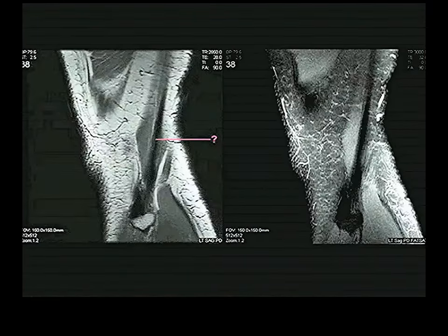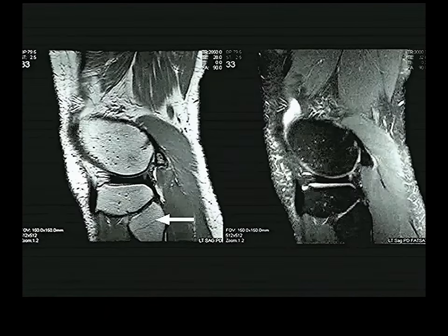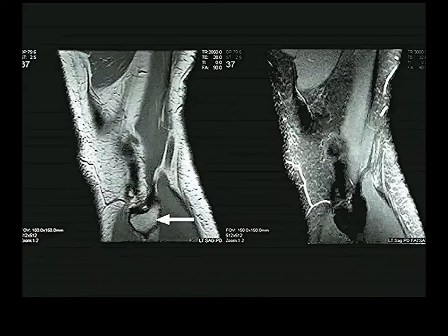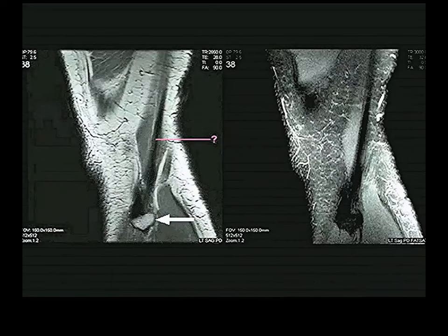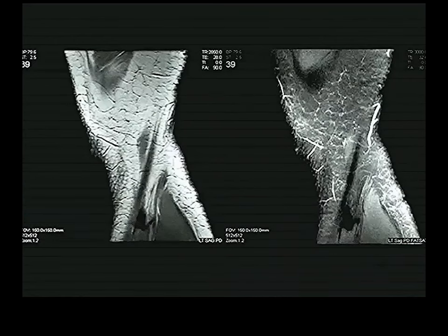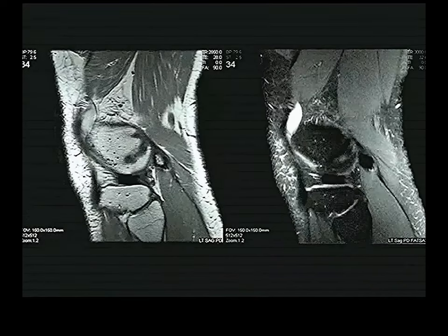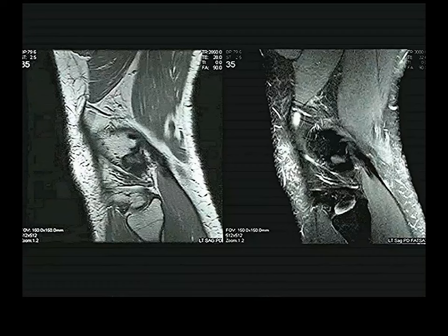Going further laterally, we see something inserting on the head of the fibula — that is the biceps femoris tendon going to the head of the fibula. Sagittal sections are not the way to see the collateral ligaments — you need coronal plane MRIs for that.